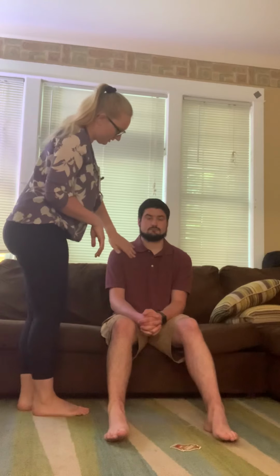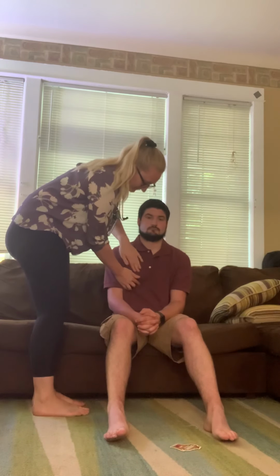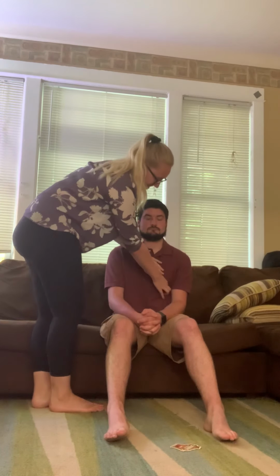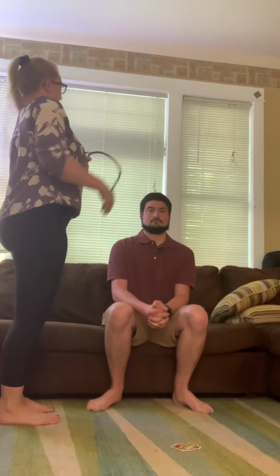Okay, next thing I'm going to do is take a listen to your heart and lung sounds. I am going to begin by just palpating the area, making sure that there are no masses that I can feel from the top layer. Okay, now I'm going to take a listen.